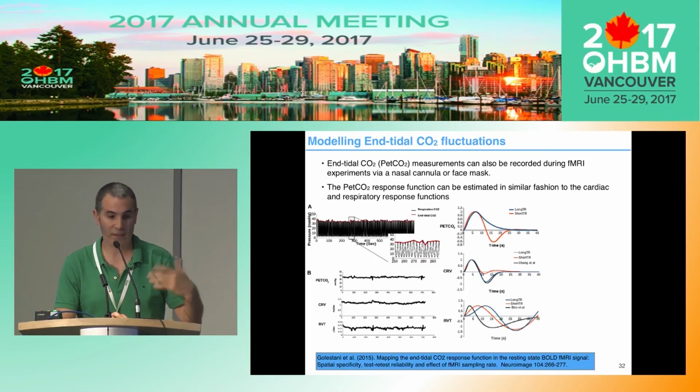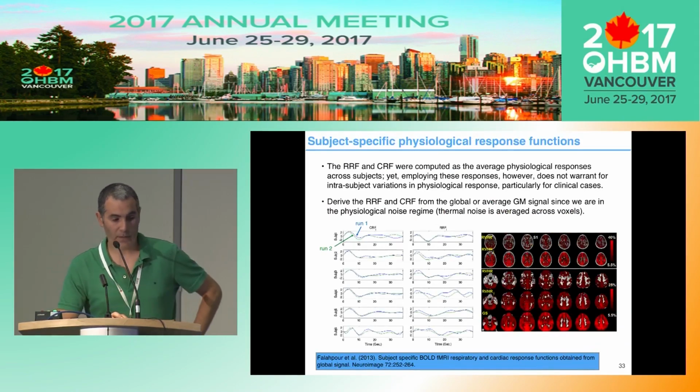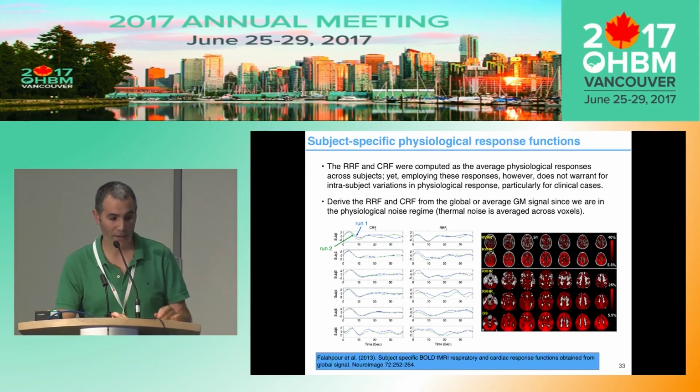And you can more or less do the same procedure in order to estimate the response function from the end-tidal CO2 changes, or the cardiac rate, or the respiratory function. It's important to notice that the cardiac response function and the respiratory response functions could vary across subjects. So on some occasions, and mainly in clinical cases, it might be particularly useful to estimate those functions at the single subject level, so for each individual subject.